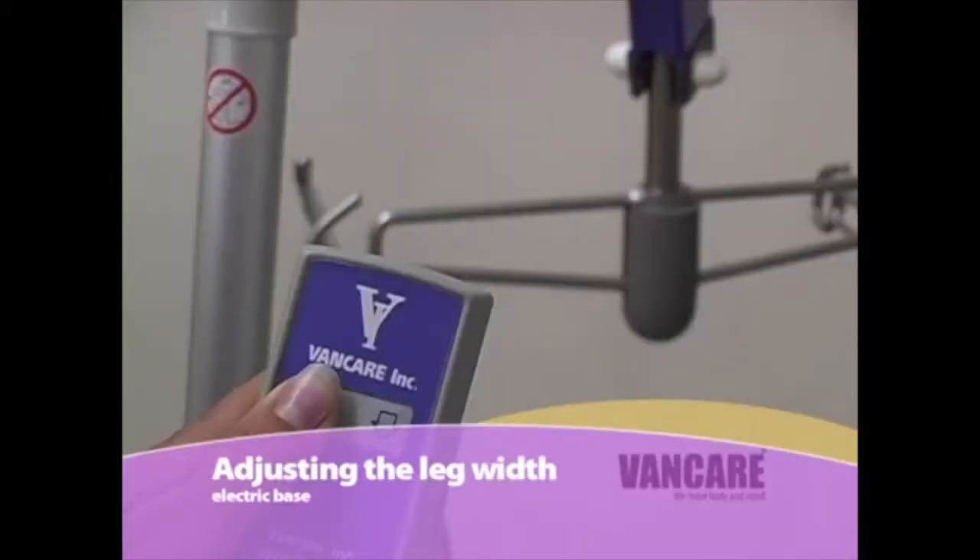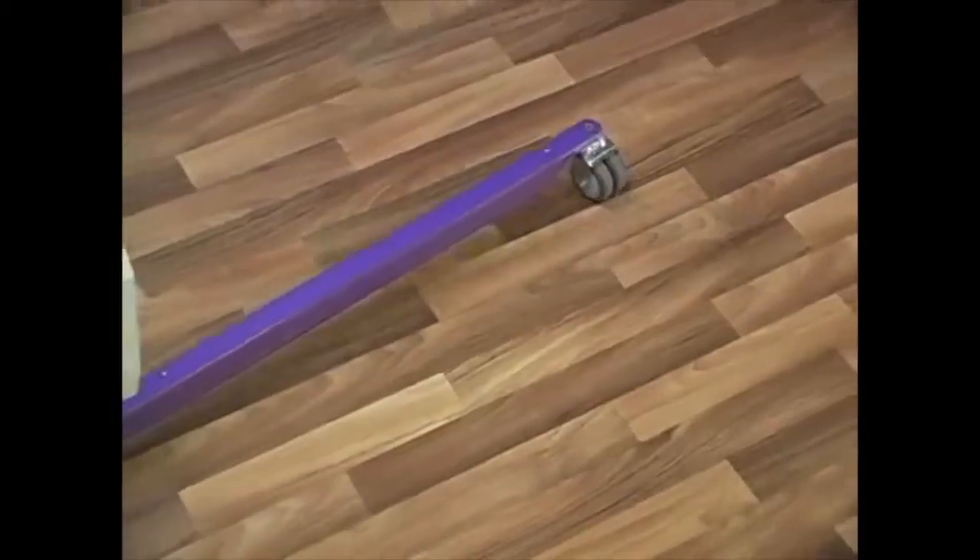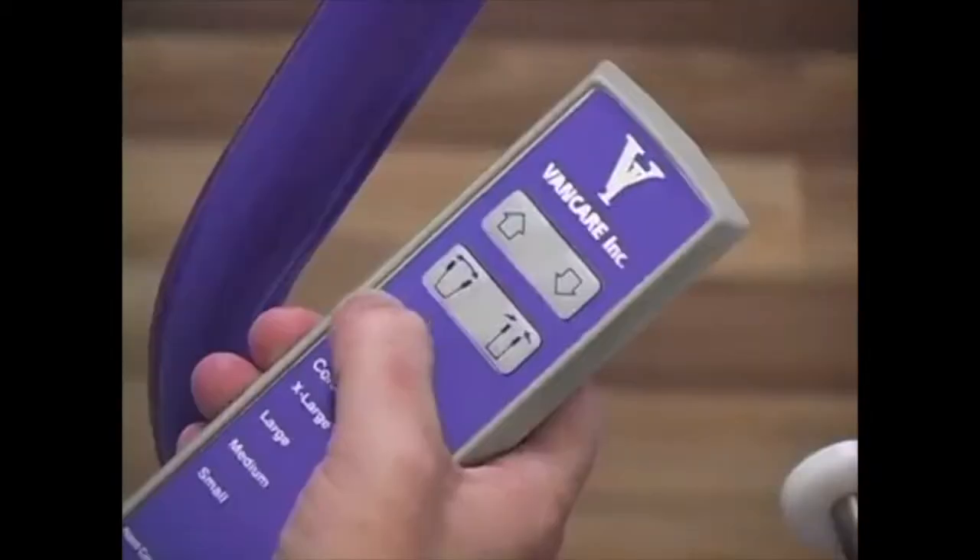Adjusting the leg width — electric base. The same rules apply for the electric base as discussed on the manual base. To adjust the width of the base, select the buttons with the arrows pointing outward and press and hold the button in. To close the legs, use the button with the arrows pointing in.